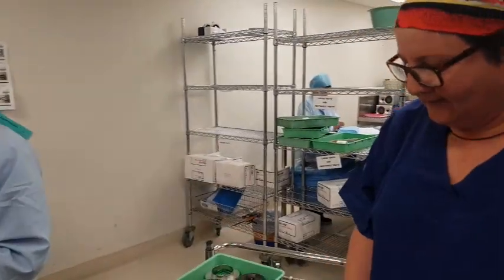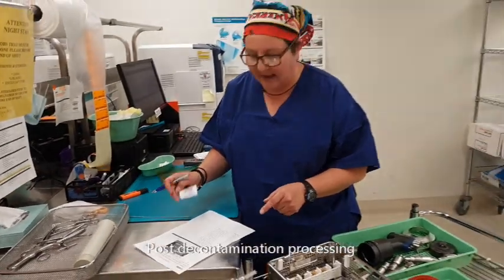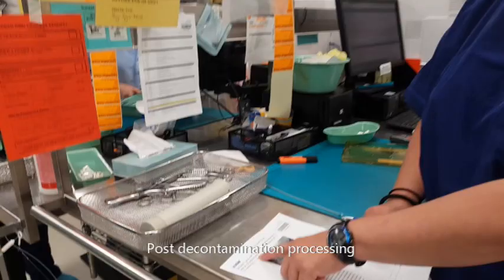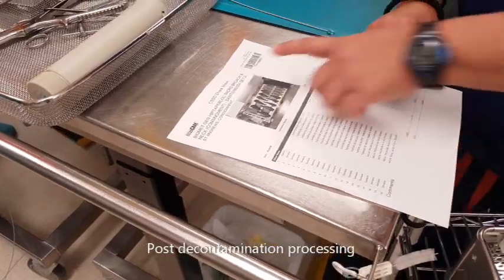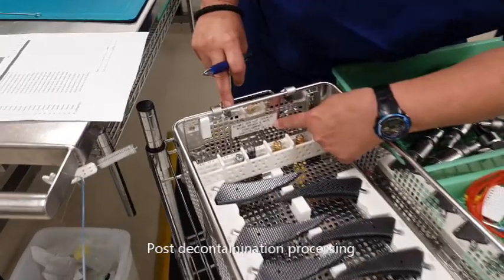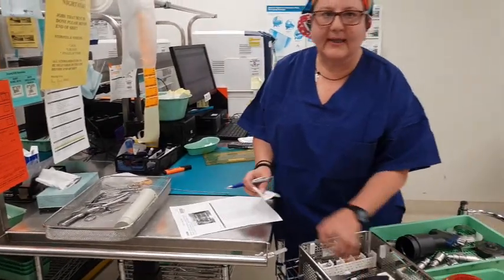All right, so Des is going to show us some broaches that we've used for a hip replacement today. That's right. Just to make sure that it's the correct tray, I've got the name of the tray up here: Biomed General Hip, Taper Lock, Micro Broach and Neck, Tray 4, Set 2. And on here, it has the same name. So we make sure that it's exactly the same paperwork for the same tray.